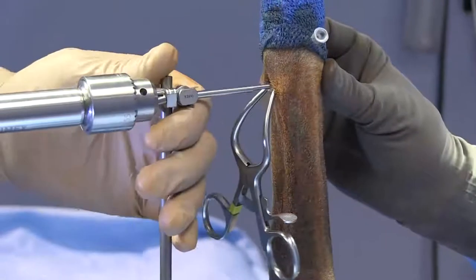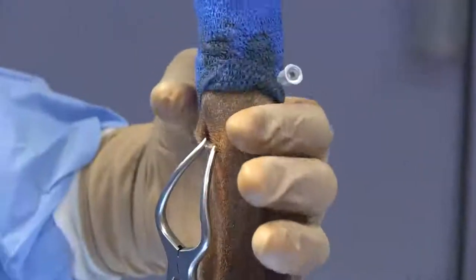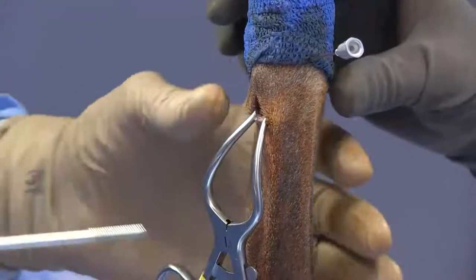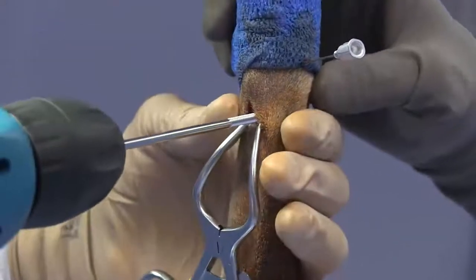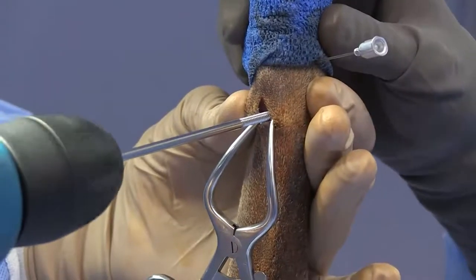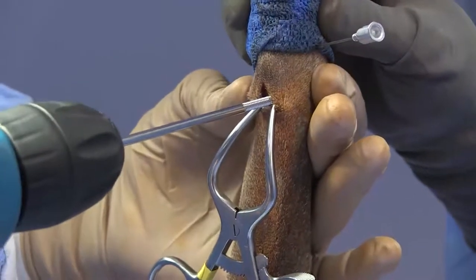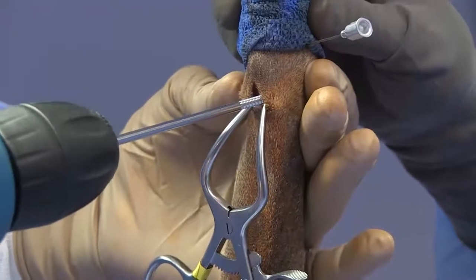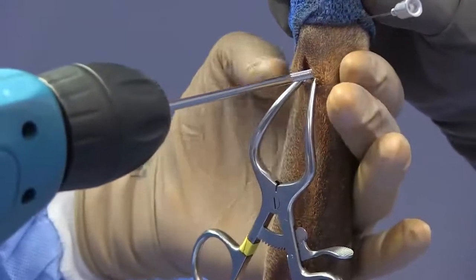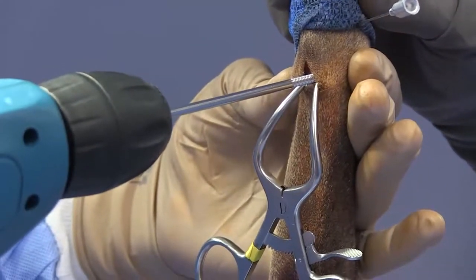We've got our drill hole and we're ready to insert our fixation pin. One thing to keep in mind is that the pin shouldn't be more than 25% of the bone diameter — that was assessed when deciding pin size. We want to insert this at a pretty low speed. You can use either a power drill or a Jacob hand chuck; both work fine. The Jacob hand chuck gives you a little more tactile feel for where that hole is.